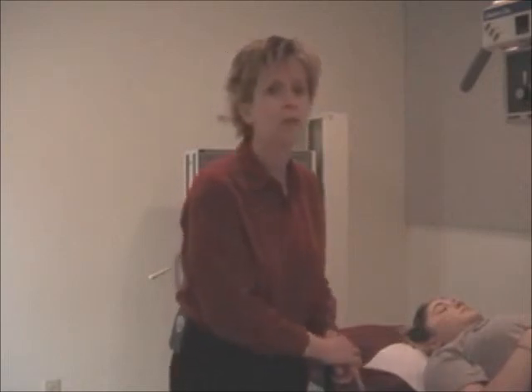But many times the elderly cannot go onto their stomach, so you would do APs. What the doctor protocol calls for, that's what you'll perform. Or logically, if given the choice, you prefer to do PAs with APs as a secondary backup. You'll get good films, but they just won't be as good as PAs.